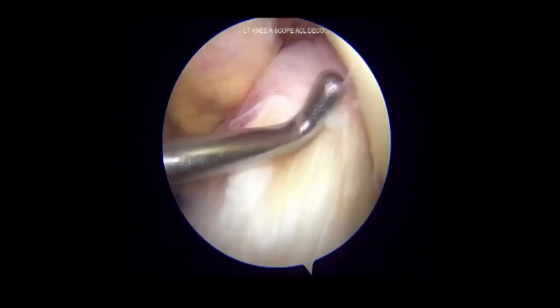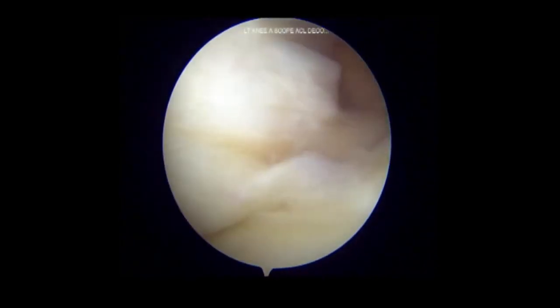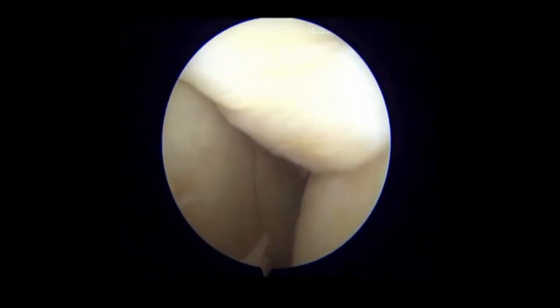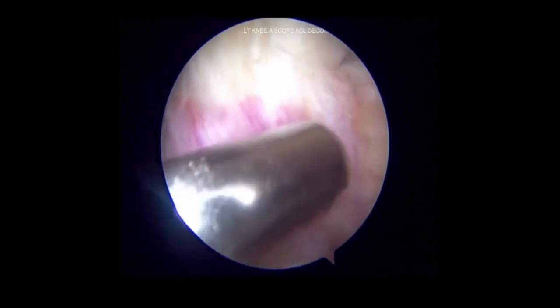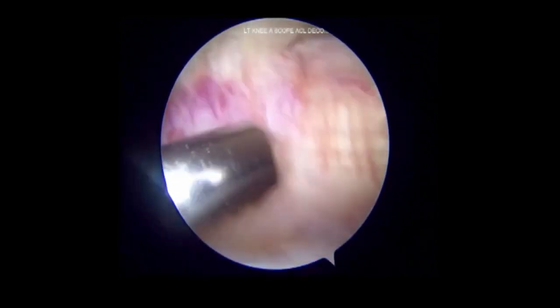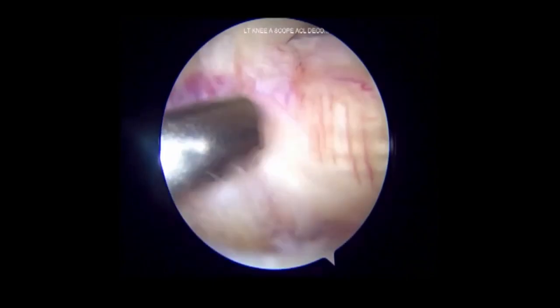The femoral side ganglion is seen in the anteromedial bundle of the ACL. The knee is then moved into figure of 4 position to analyze the femoral footprint. The knee is moved back to 90 degrees of flexion and the tibial side ganglion is shaved off using a 3.5 mm shaver tip.